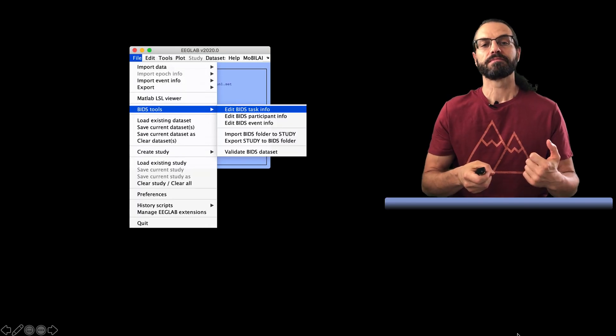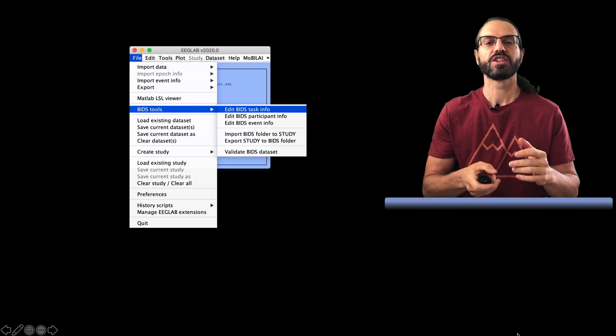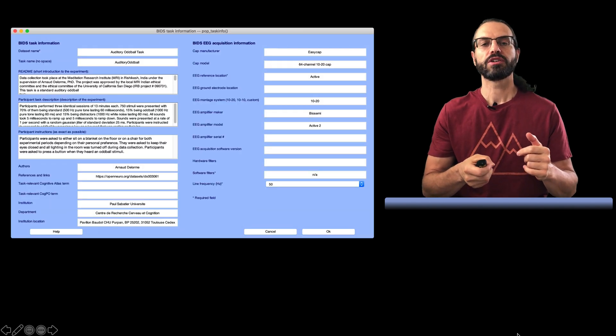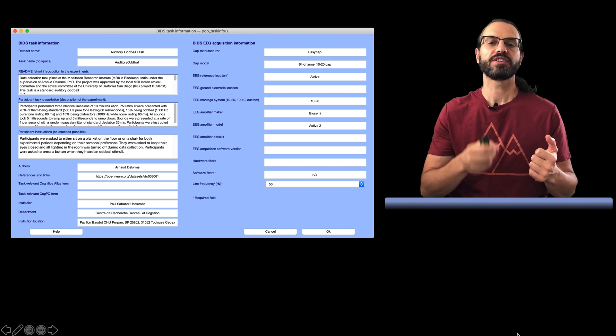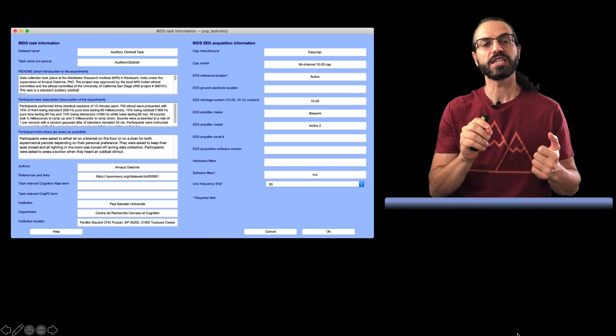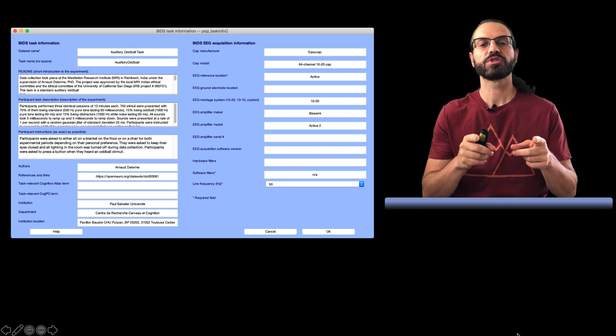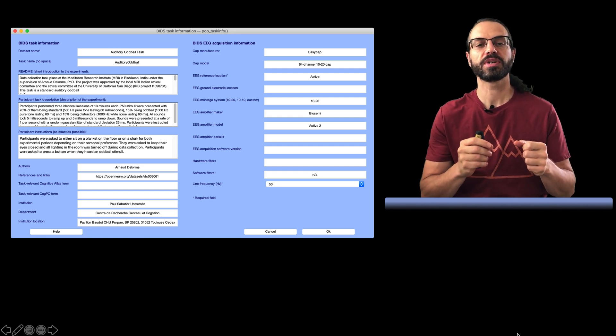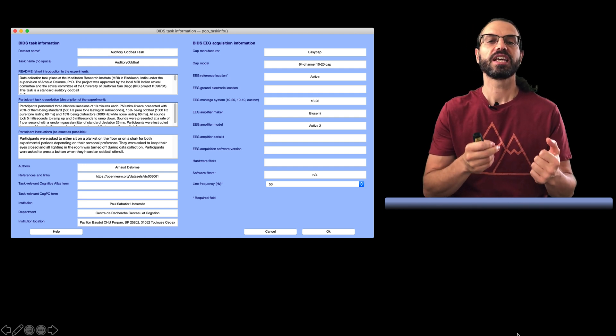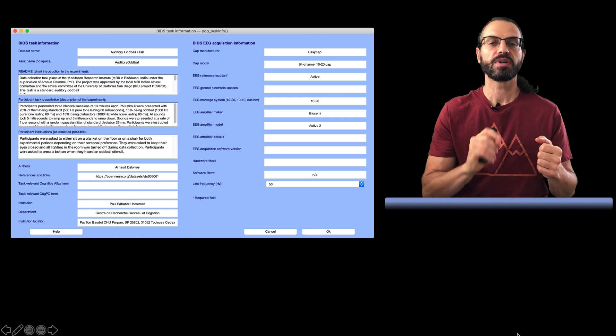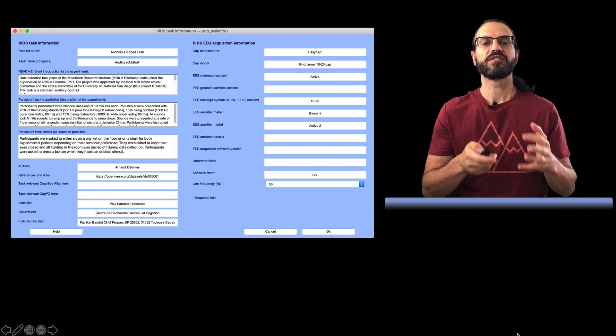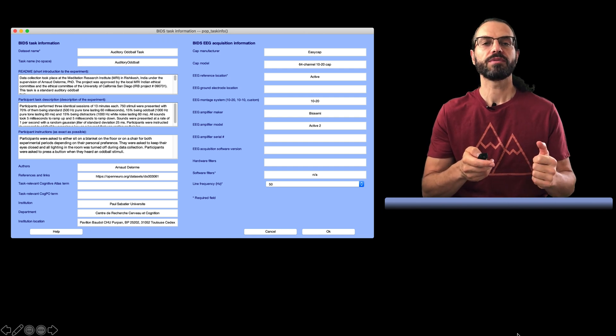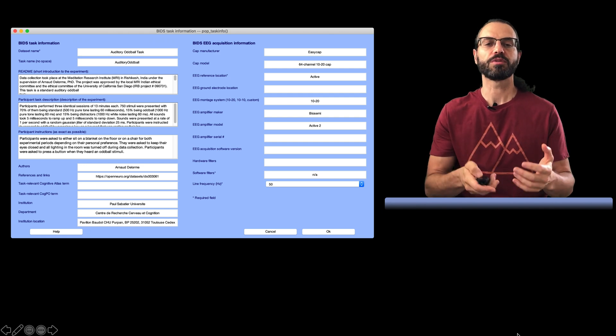Now, moving on to BIDS. Let's first enter task and experiment information. So this is this menu item. So here it's pre-filled, but obviously you will need to fill that information yourself. We have a dataset name, then a dataset name with no space. Then we have a short description that will be stored in the README file. Then we have the description of the experiment and instructions given to participants. Then we have authors, publication references if any, and lab information. On the right column, we have amplifier and EEG cap characteristics. Most of the fields on these forms are optional, but obviously it will be harder for other people to use your data if there is missing information.